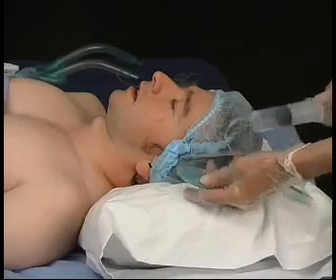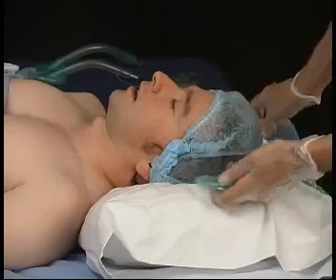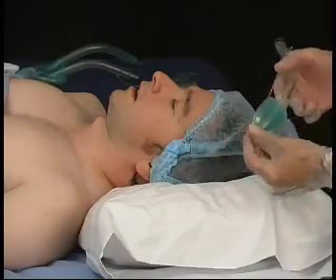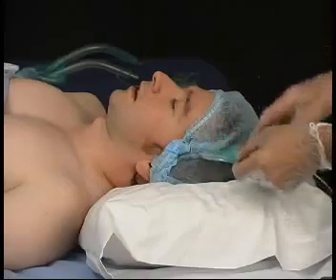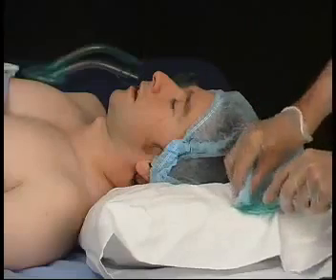Contrary to some popular belief that there should be some air in the cuff, this is not so, because a filled cuff can collide with the epiglottis. Next, prepare the Solus for insertion by putting some gel or lubricant on the back of the cuff. Just on the tip of the backplate is all that is required.